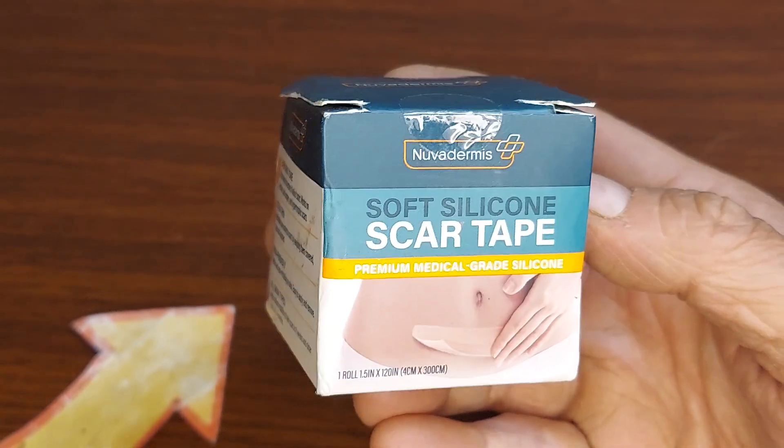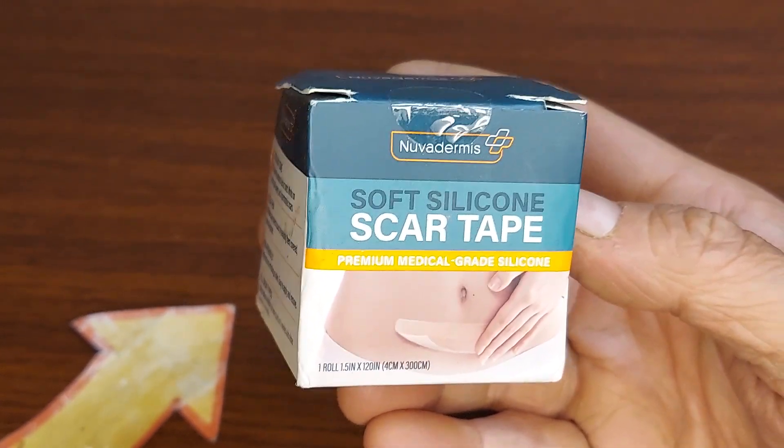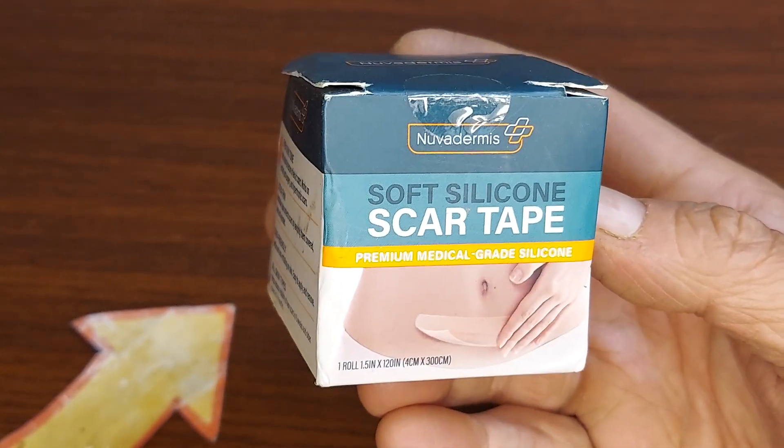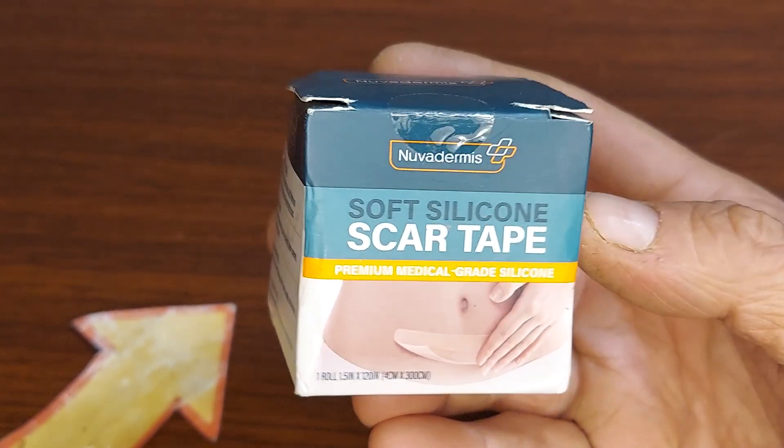When you want that scar to heal, having some protection but also a breathable layer — this soft silicone is breathable.